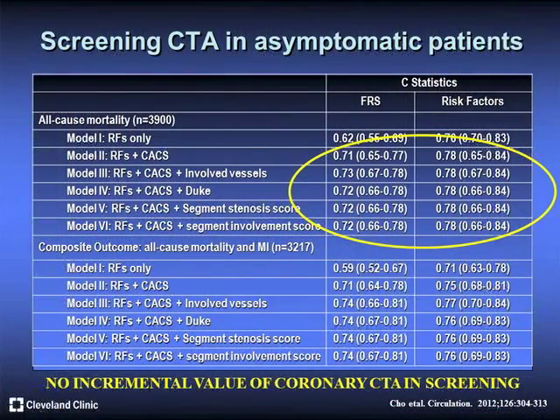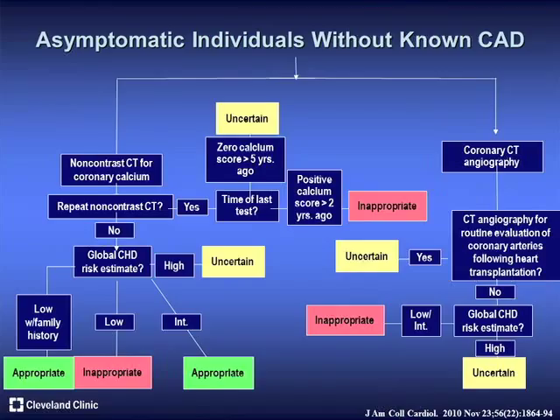Now, changing gears a little bit, is there a role for CT coronary angio? And we will talk about other indications in detail. For an asymptomatic individual who is coming in worried well for screening purposes, according to this study published a year ago, there is no incremental benefit for coronary CT angio, at least in an asymptomatic person without known prior CAD.